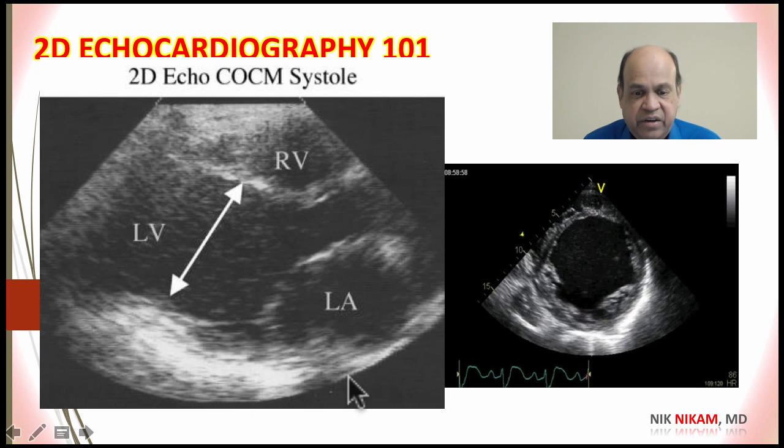Now let's get into some pathology. Here, as you can see, we have a grossly dilated left ventricle. The left ventricular wall is thin, and the left atrium is also dilated. Similarly, we have a cross section of the left ventricle where the cavity is grossly dilated with poor contractility. This will represent an example of far advanced congestive cardiomyopathy.